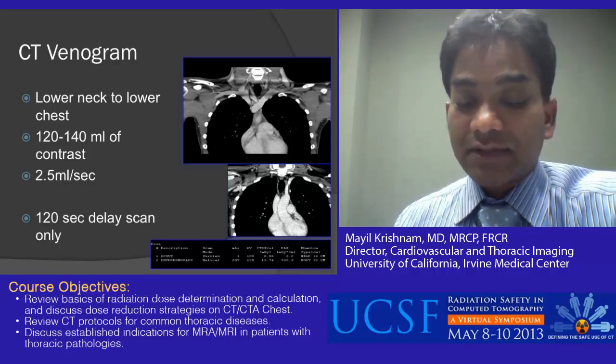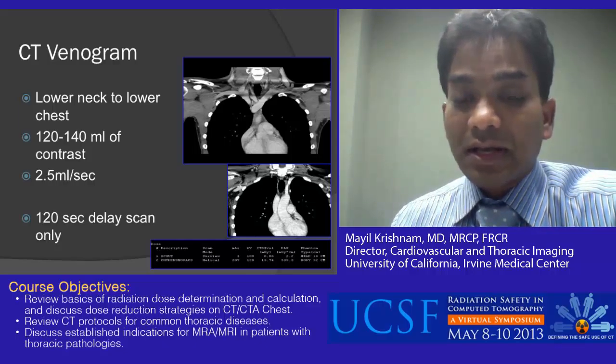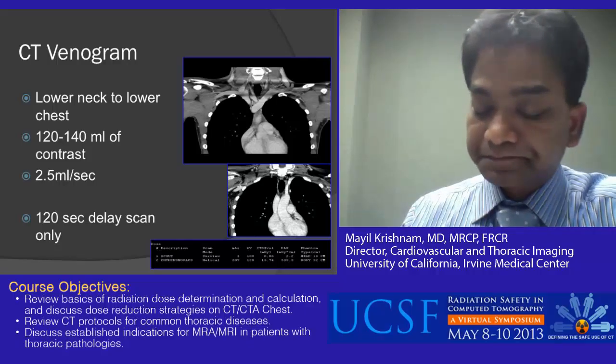And if you see the dose page for this patient, at the bottom we did only one scan, and it nicely shows the brachiocephalic veins, then SVC, and you can also see some thrombotic changes in the left subclavian vein. Next slide.